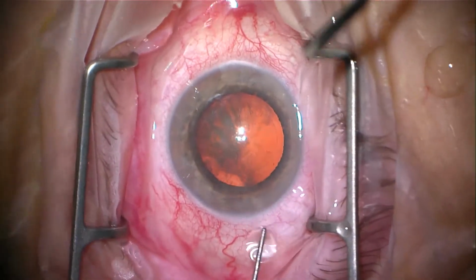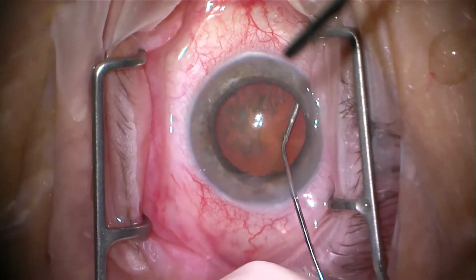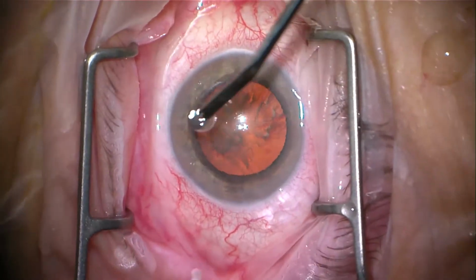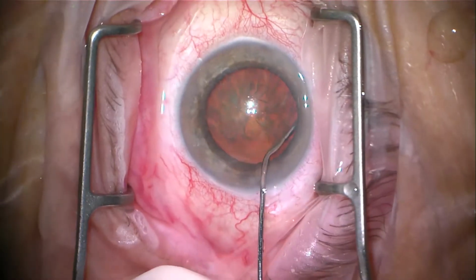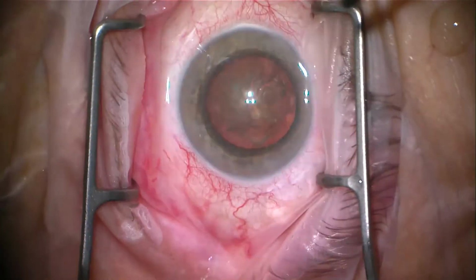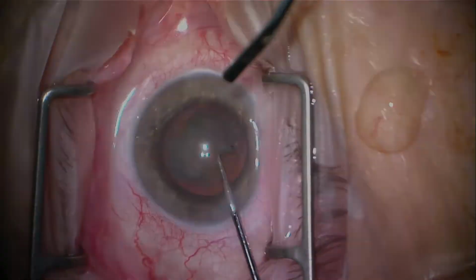Next, we've got hydrodissection, which is a stage where typically you can see some iris tendencies toward the wound, but obviously the pupil's staying very well dilated, and this is just BSS with no epinephrine being used at this stage during the phaco and all, which I won't really show. We do have epinephrine in the bottle.